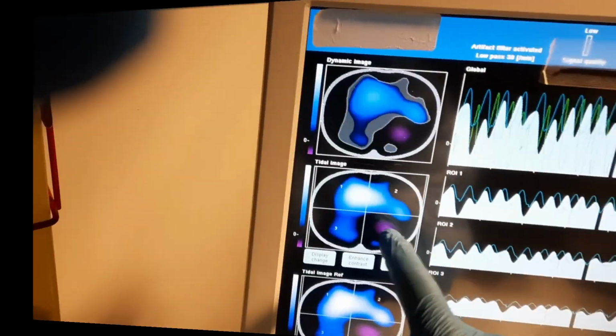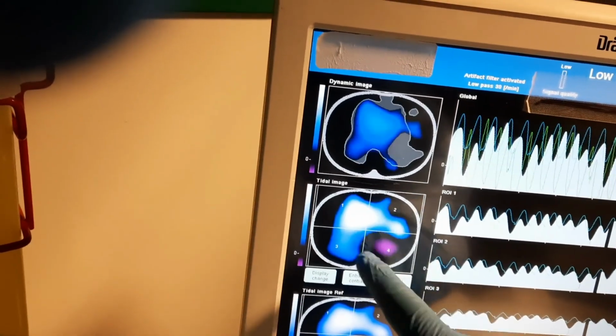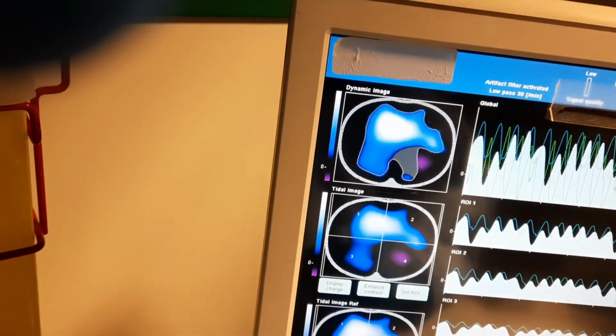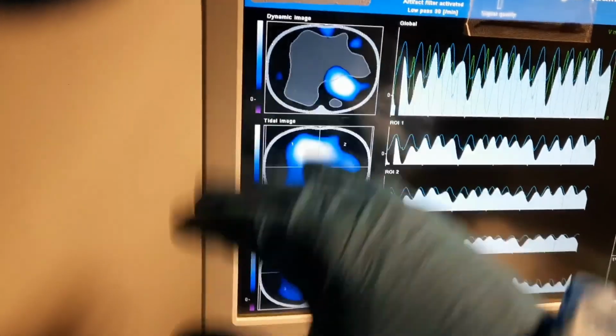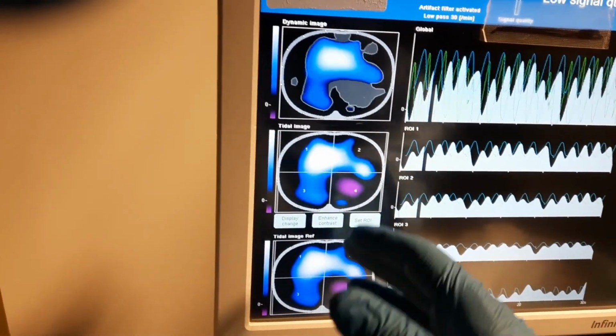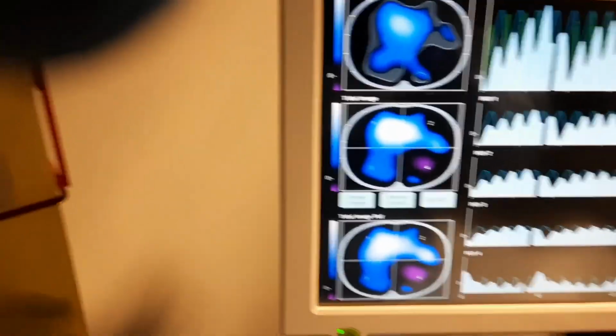Okay, so at this point we also did an incremental PEEP study in an attempt to recruit that left dorsal region. We went from 10 to 20 and then from 20 back down to 10. The patient showed no further recruitment of the desired area with higher PEEPs. Although we did occasionally see in the left dorsal region, where you see the purple negative impedance, that on expiration sometimes ventilation did occur in that area in a delayed fashion.